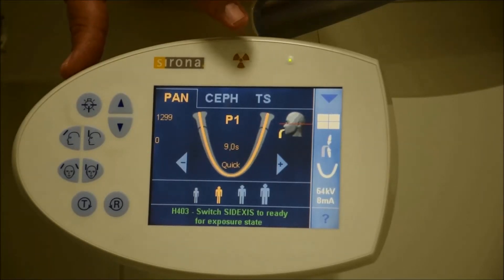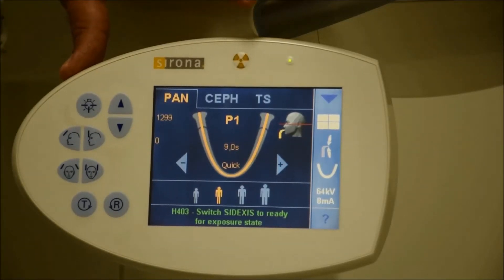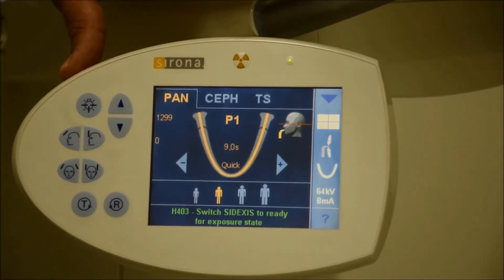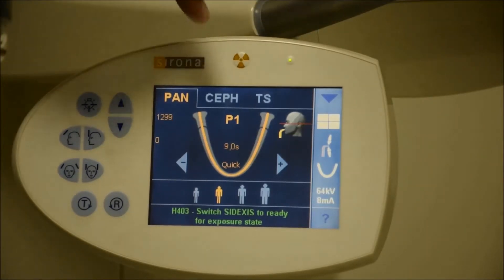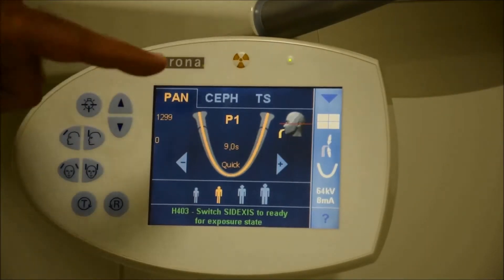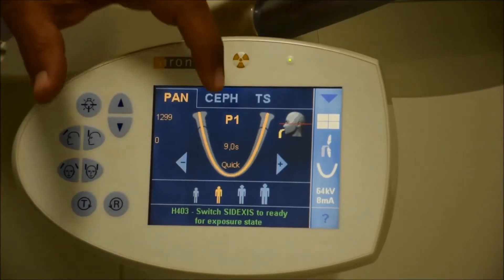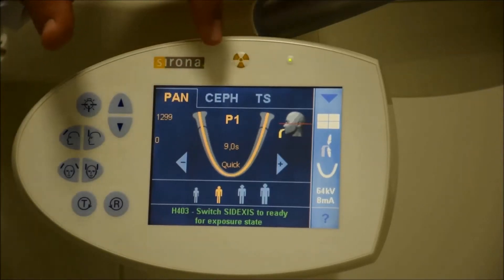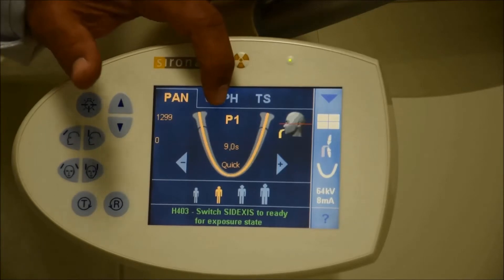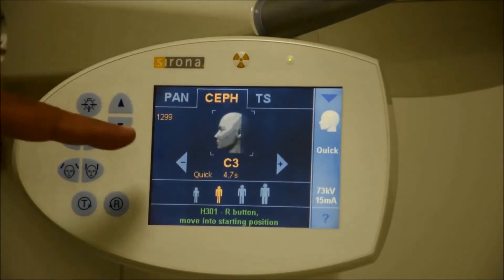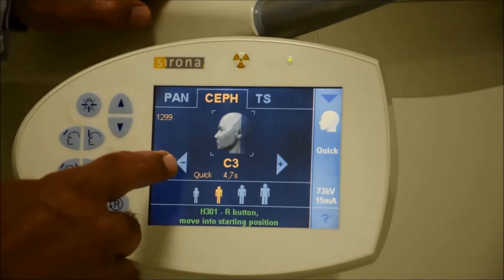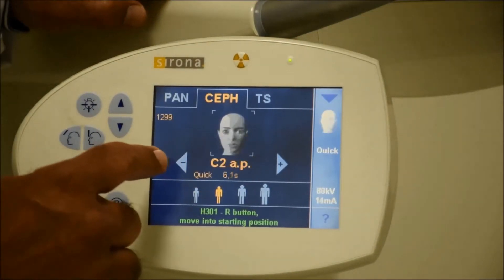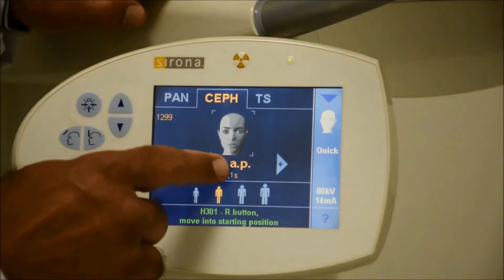First of all you choose the patient and then you activate the x-ray, regardless of whether it's panoramic — that part is the same. On the control panel, you're going to click on ceph and you will see that you have many options.